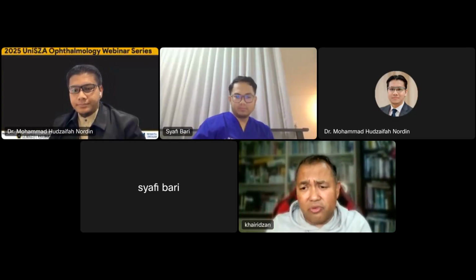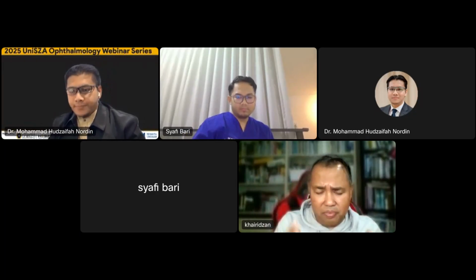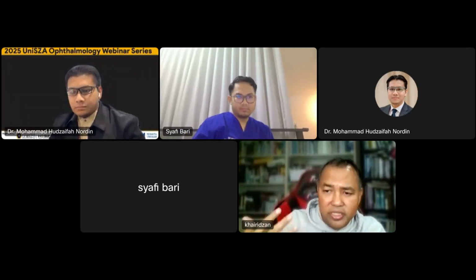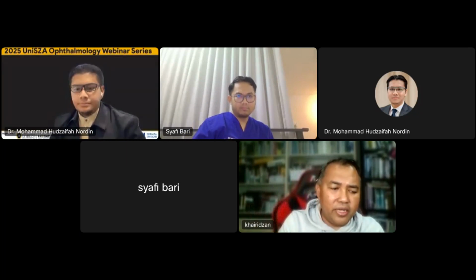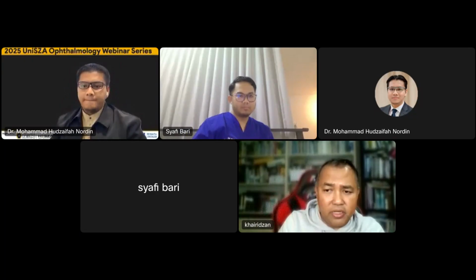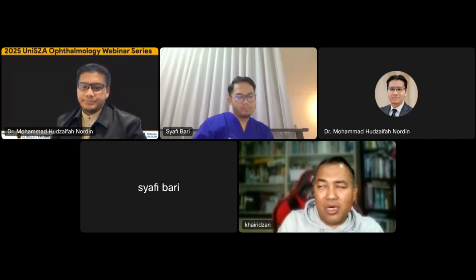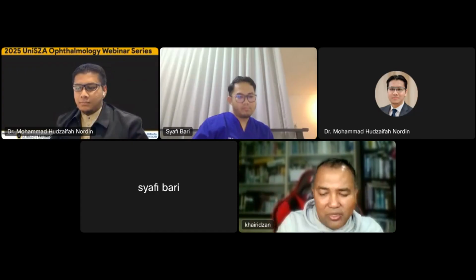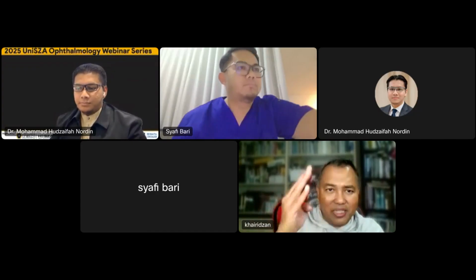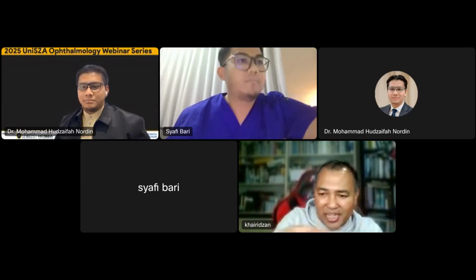I think this is the reason why we have a seminar like this for the upcoming surgeons, because all these things are very important. And Dr. Hudzaifah was talking about visual acuity assessment, and how people manipulate the contrast in that visual acuity, without looking at crowding, the crowding factor, whether you're tested with one single alphabet or with the ETDRS.